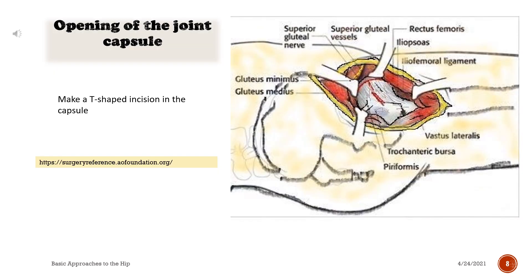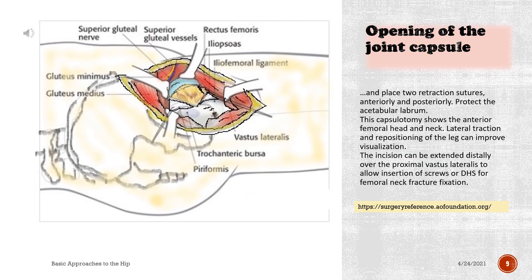Opening of the joint capsule. Make a T-shaped incision in the capsule and place two retraction sutures anteriorly and posteriorly. Protect the acetabular labrum. This capsulotomy shows the anterior femoral head and neck. Lateral traction and repositioning of the leg can improve visualization. The incision can be extended distally over the proximal vastus lateralis to allow insertion of screws or a dynamic hip screw for femoral neck fracture fixation.